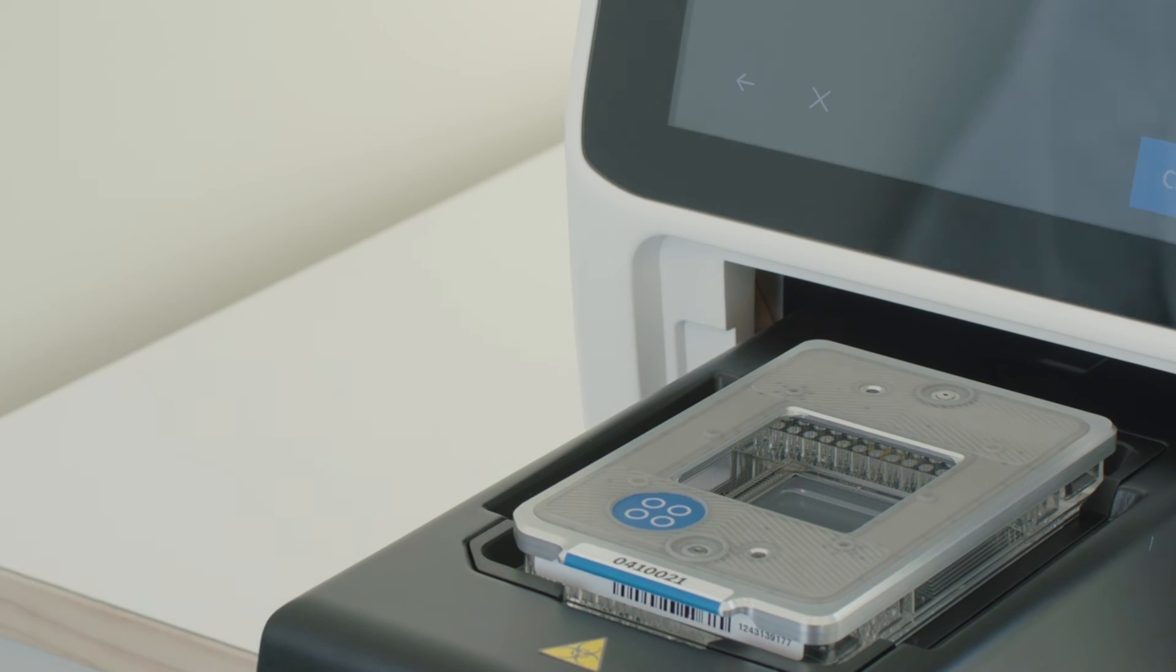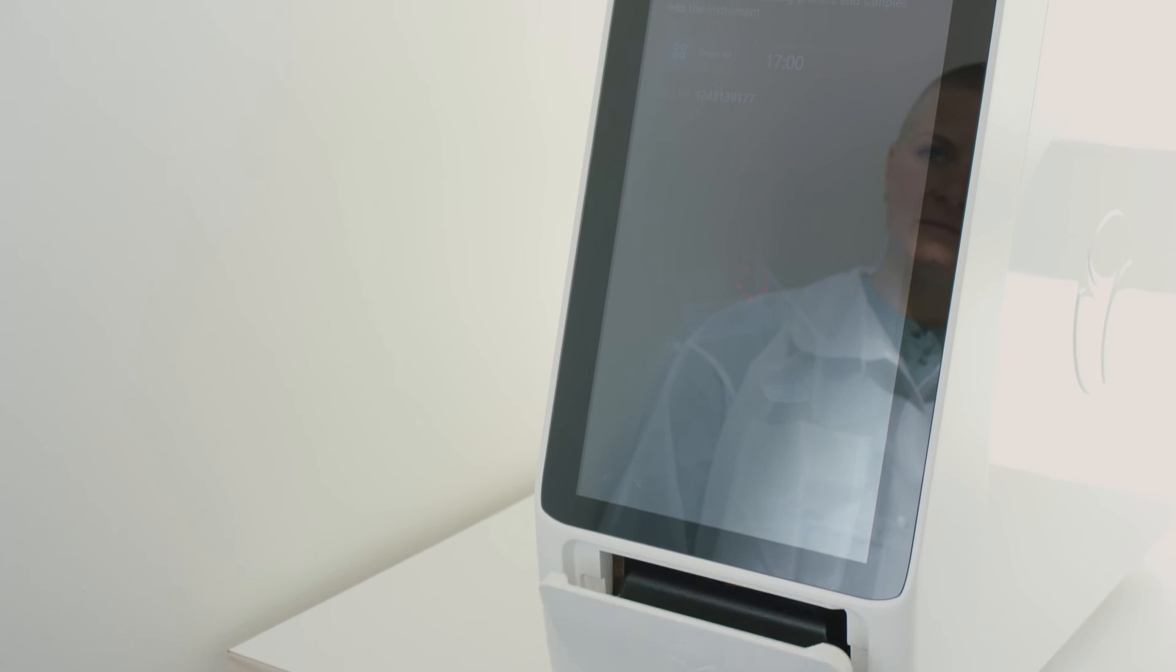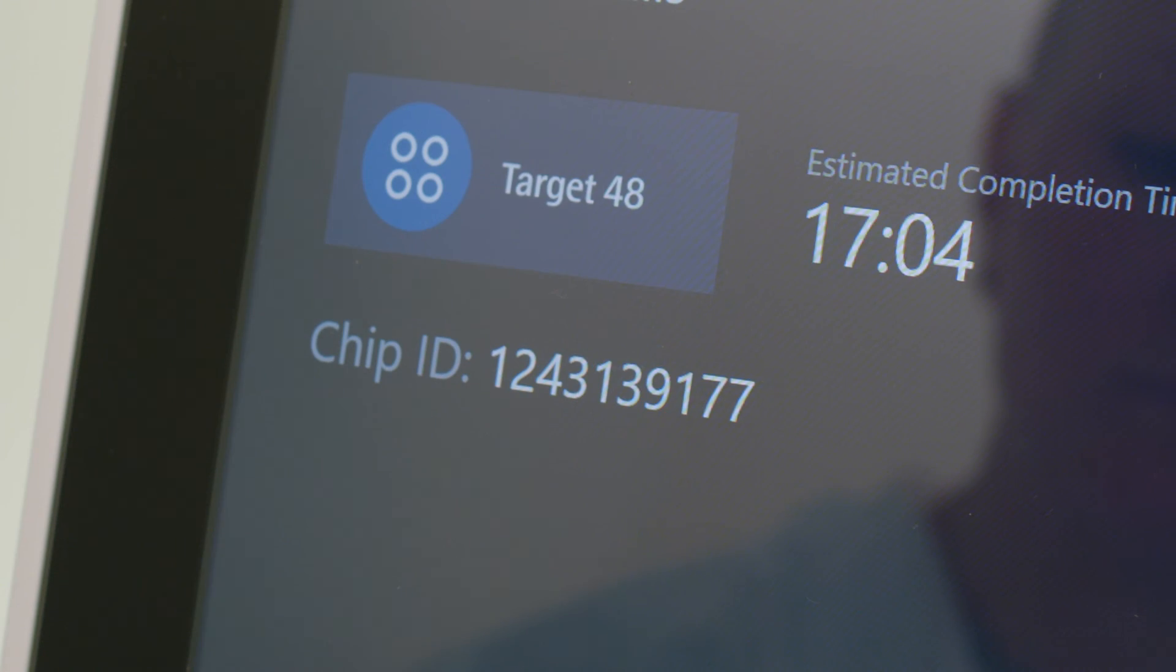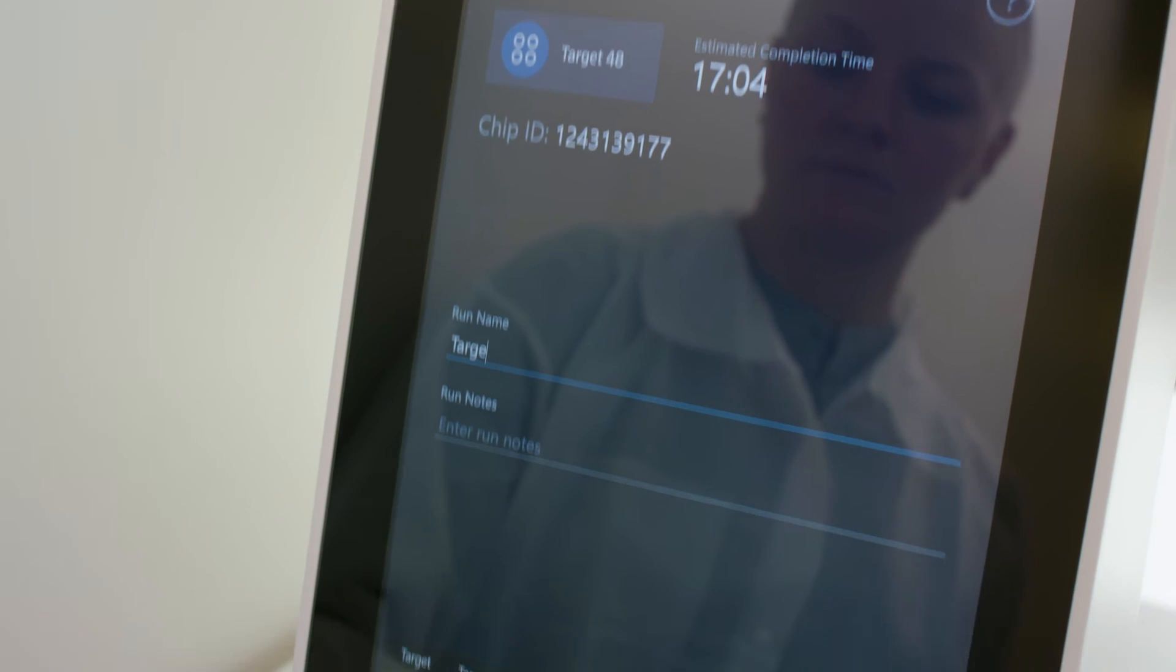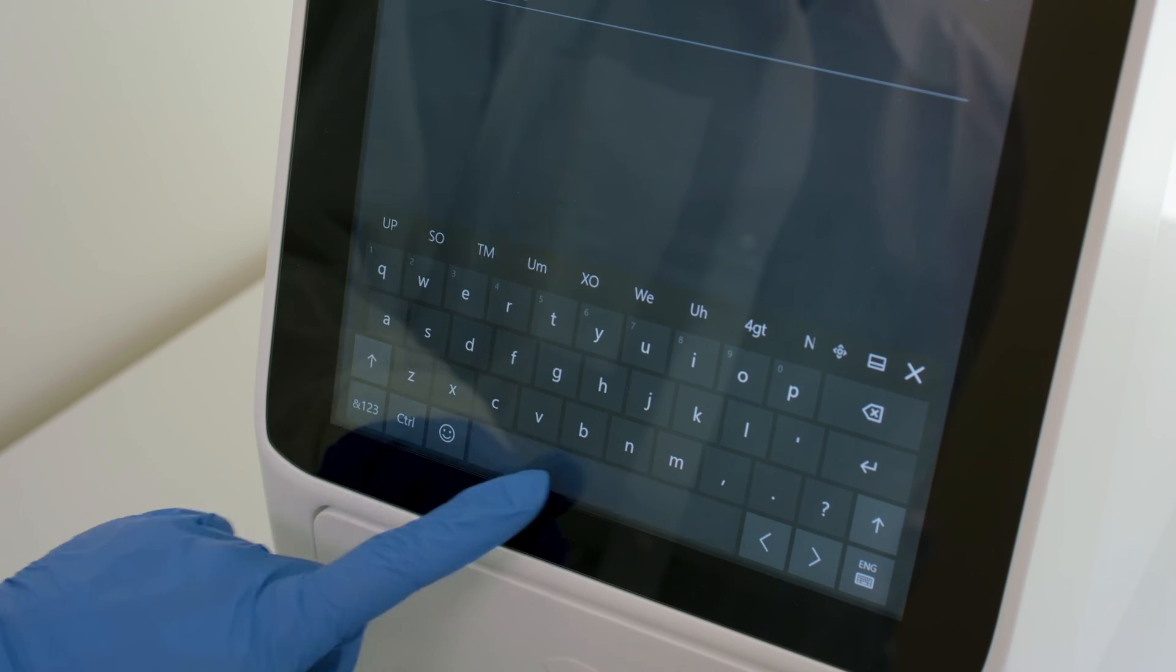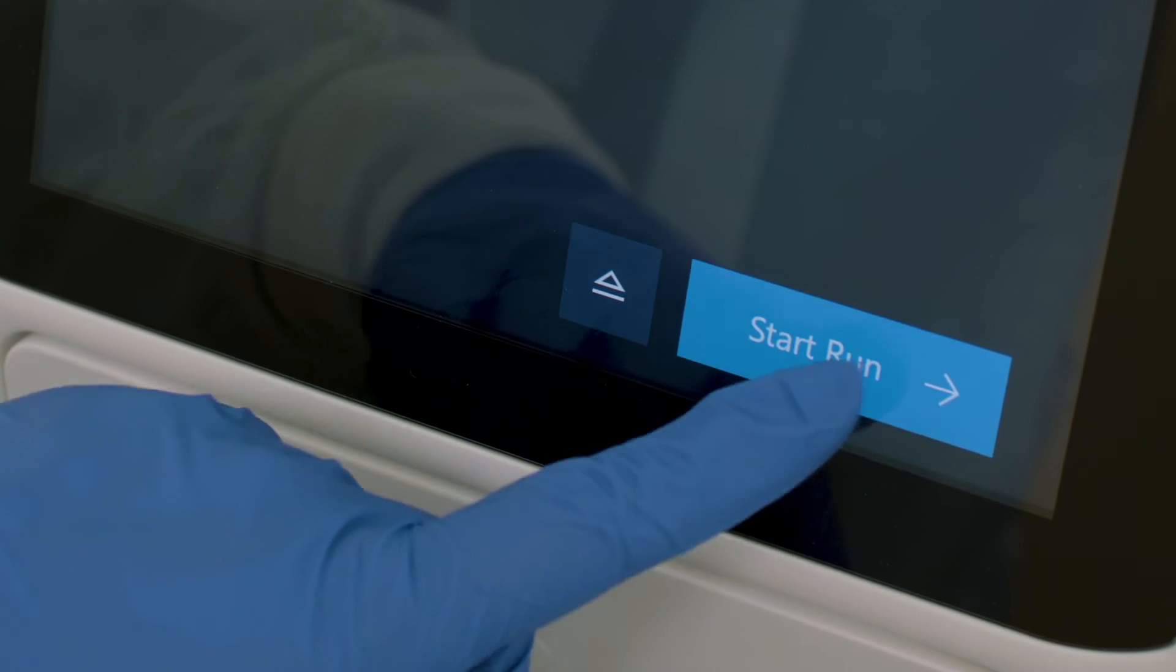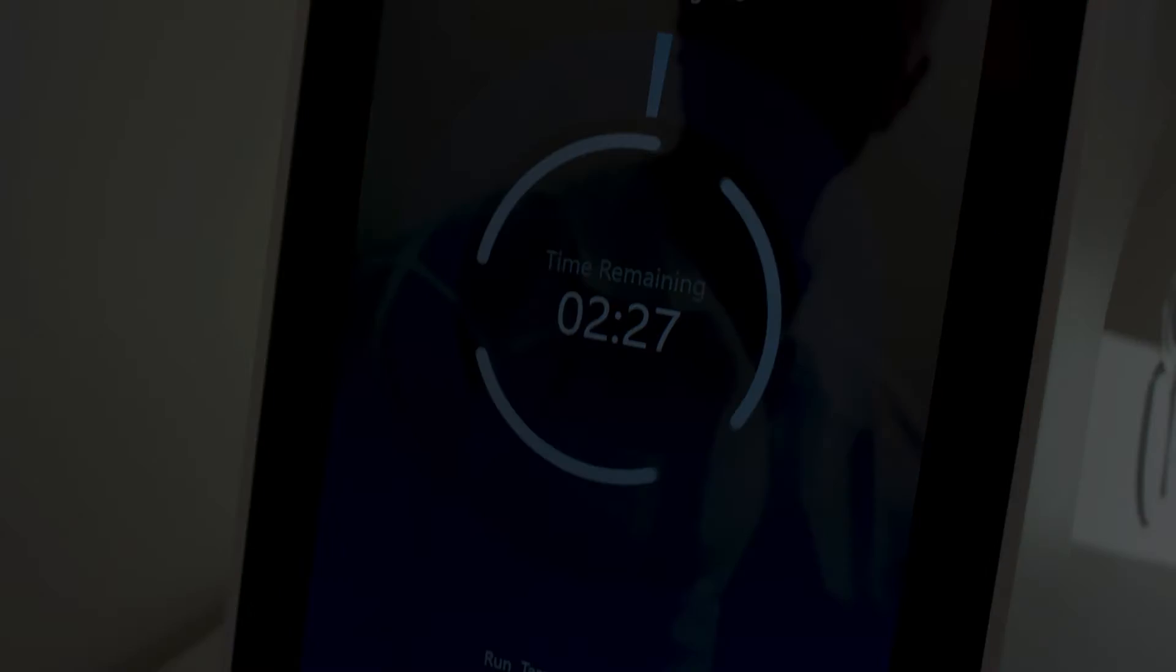Close the Shuttle Drawer by tapping Close Drawer. The system scans the IFC and interface plate barcodes, then closes the drawer. On the Add Run Details screen, confirm the Chip ID, then enter a custom run name or run notes if desired, and select the panel type. Tap Start Run. The run begins and the screen displays the time remaining. Tap Finish when the run is completed.